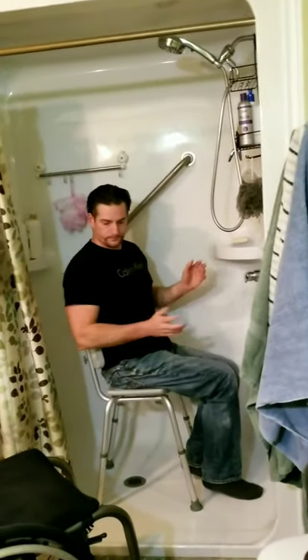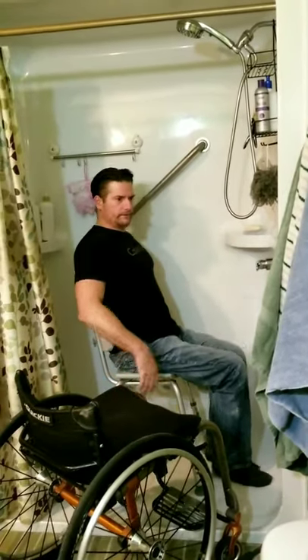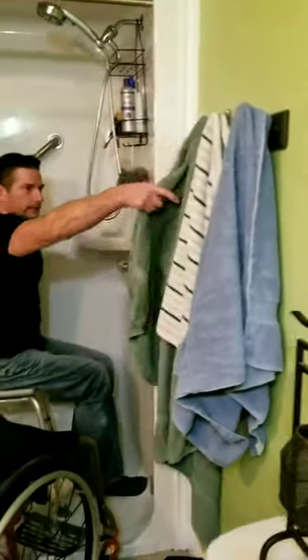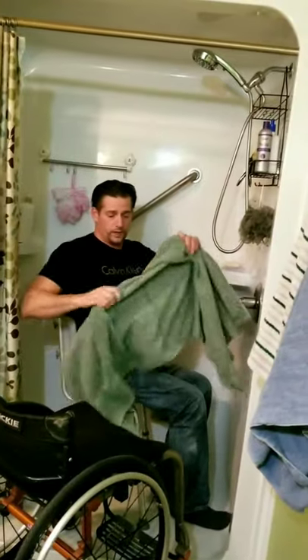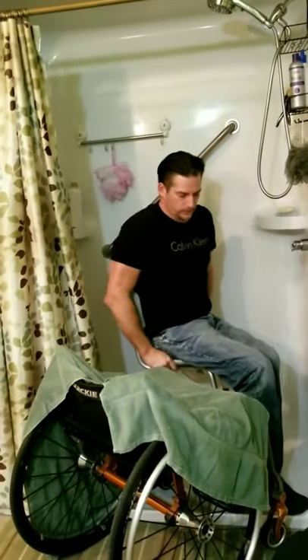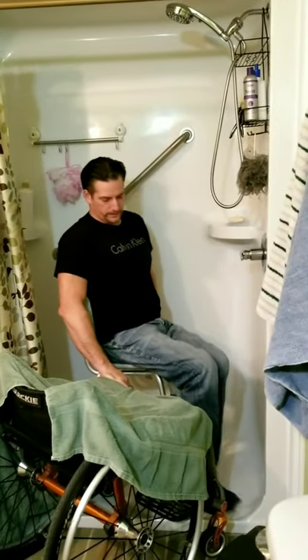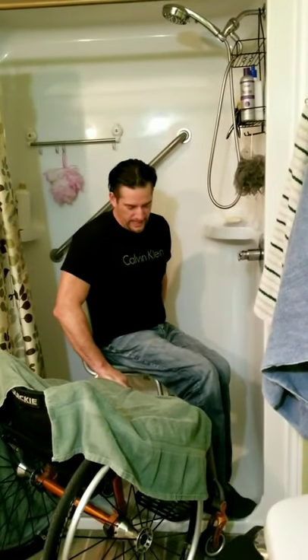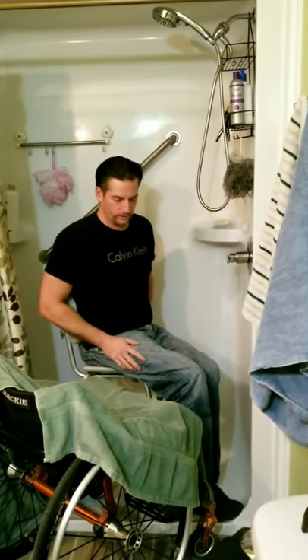When I'm all done showering, I'll bring my chair close to me again. I have a towel handy — I'll first dry off as much as I can in the shower, then I'll place my towel on my chair like that. Then I scoot my butt at an angle toward the chair, bring the chair in, with my feet still inside the shower but just enough room to easily pivot over.